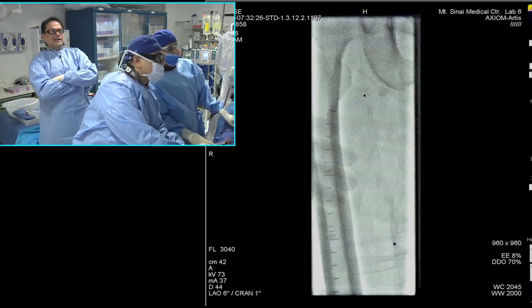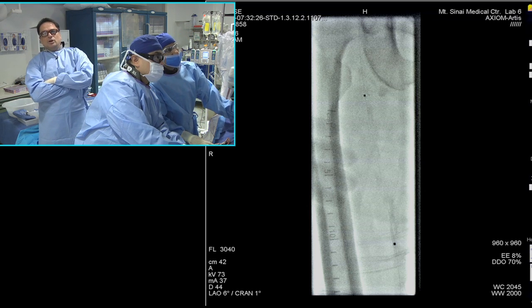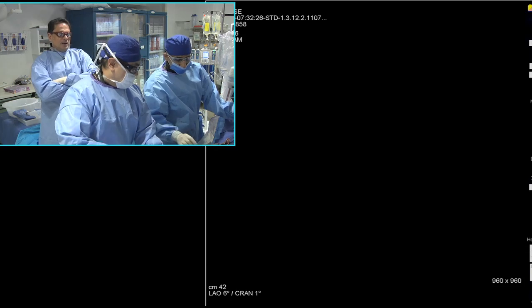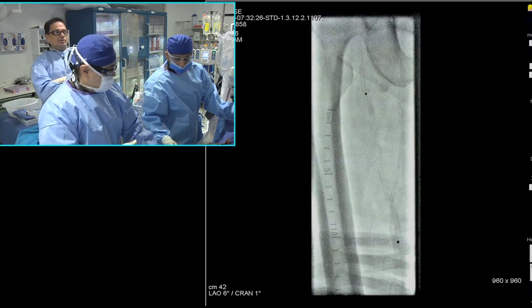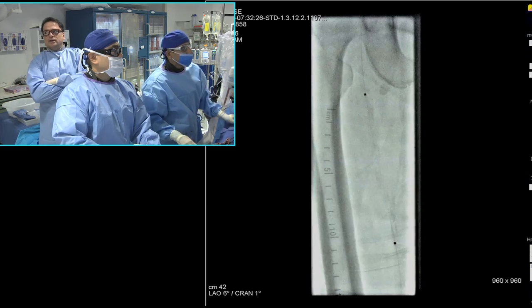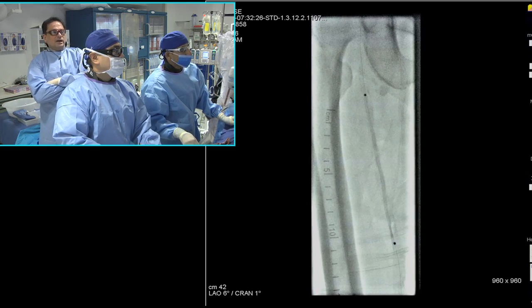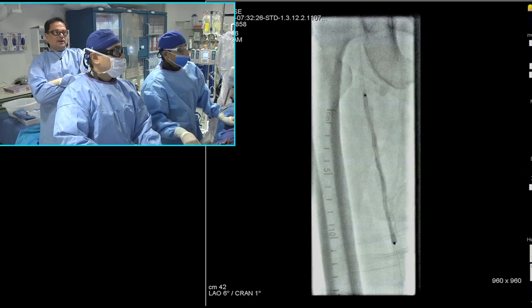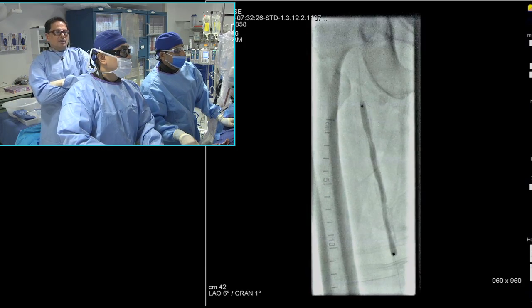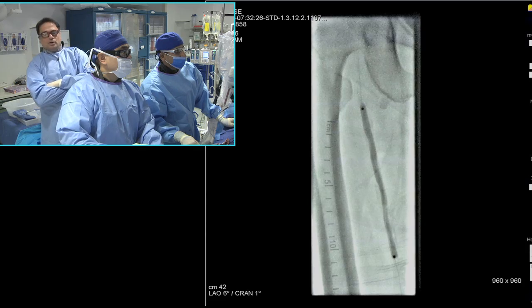But I think in today's day and age, this case demonstrates what the available data is and how we make those decisions. I know that yesterday, Vishal, you remember, we were talking with Europe, and especially Andrew Holden and all the guys in Europe when we did our pathway case. They felt that the absorption with calcium will be limited. We didn't have time because it was a 20-minute session.